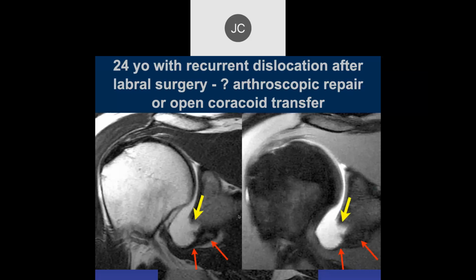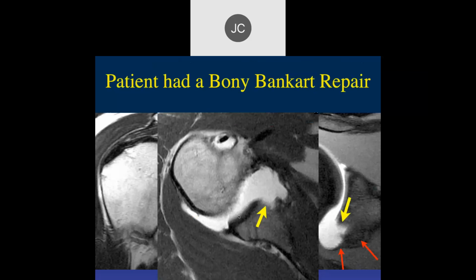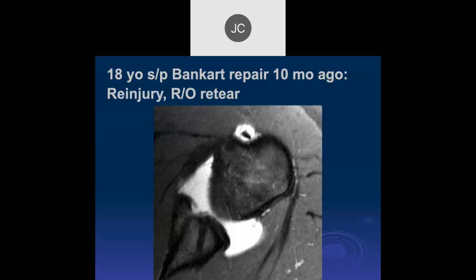So that's what we do now. Back when we had this particular study, it was before a lot of those papers came out. So in this case, the correct procedure was done, though now you know how you want to evaluate this and help the surgeon. Okay, Robert.